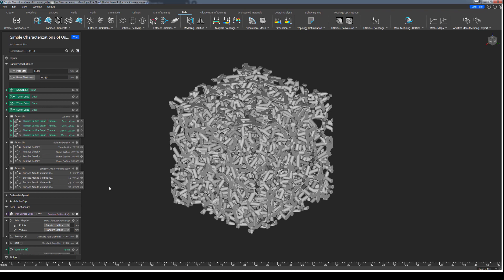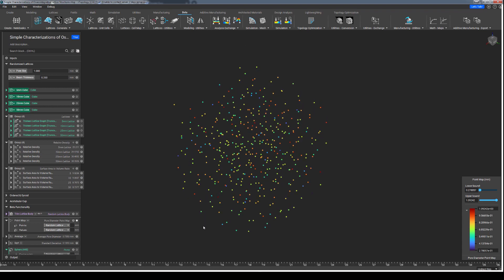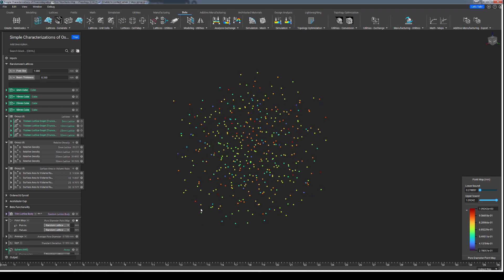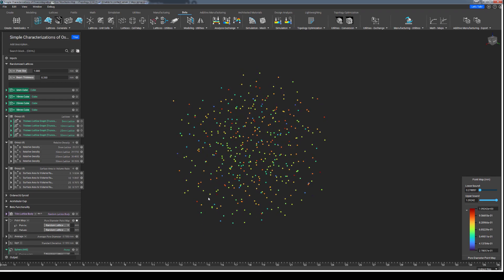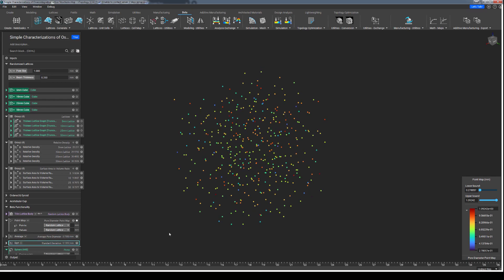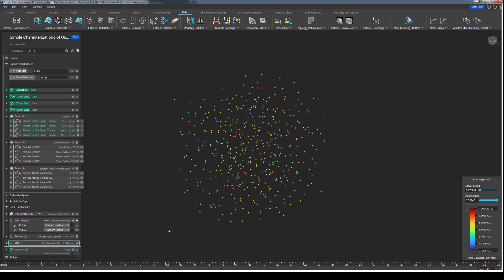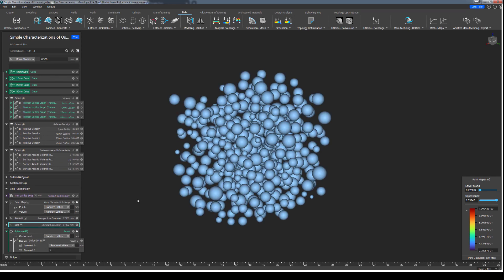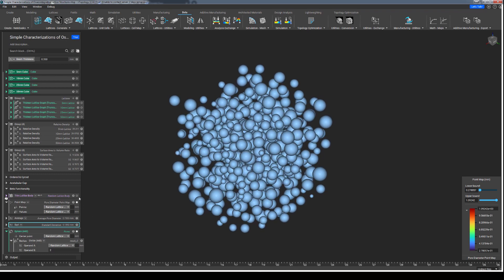Using this pore size data, we can represent it as a point map where we can get a visual understanding of what the distribution looks like as well as perform some analysis on the data set. We can get an average of the pore size as well as a standard deviation value from that average. In addition, we can even use that point map to create representative spheres that will allow us to visualize the pores themselves and what is actually being measured.